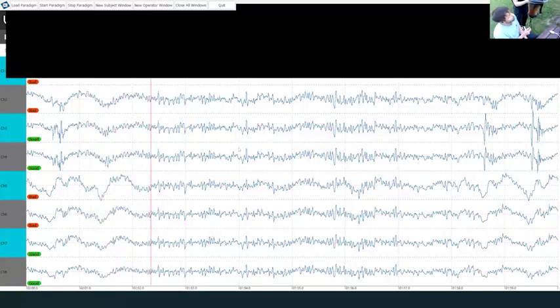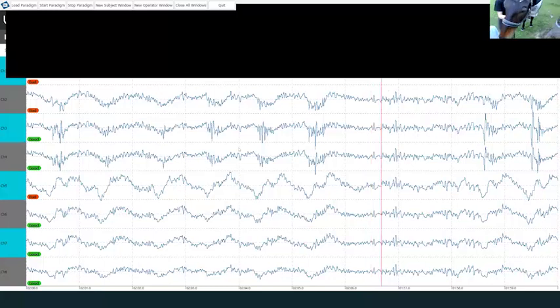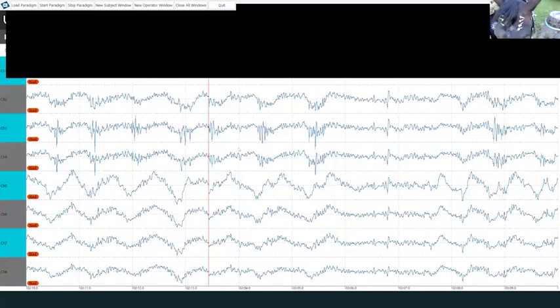Of course, there is also the option to place the electrode centrally, for example, but we also don't want too much EOG in the reference, so we don't want to place it there.